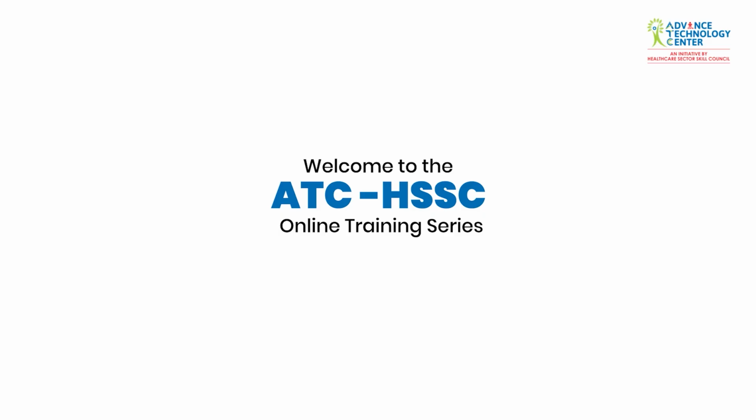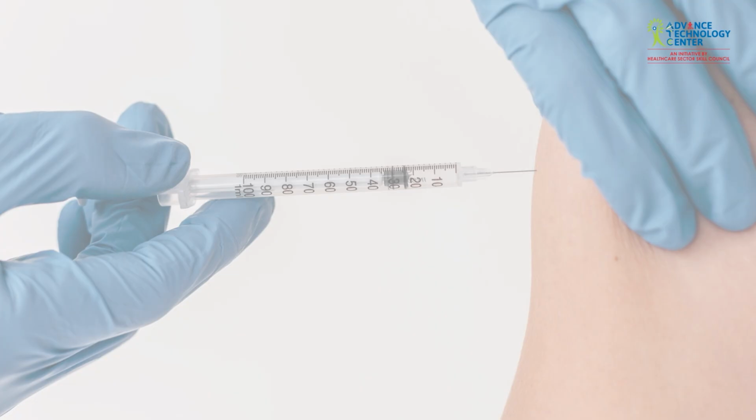ATC-HSSC online training series, where you learn essential procedures that ensure safe and effective patient care. In this video, we'll demonstrate the correct technique for administering a subcutaneous injection, including when it's indicated, how to prepare, and how to perform the procedure safely and effectively.